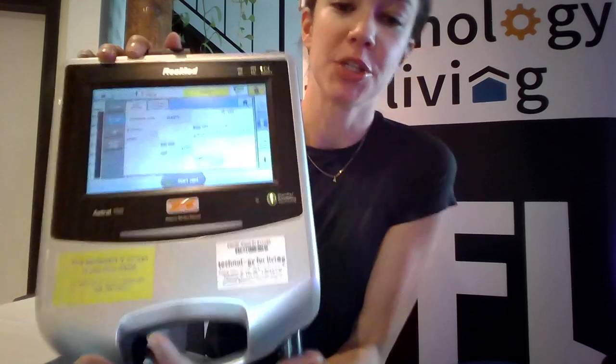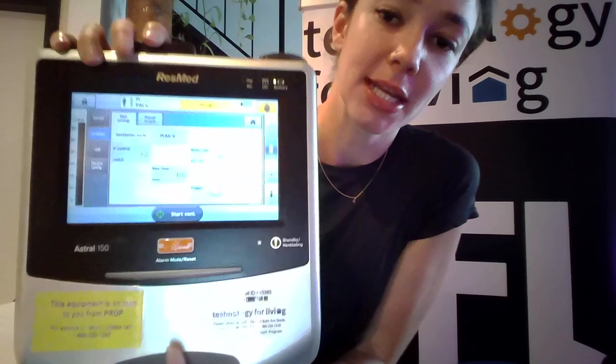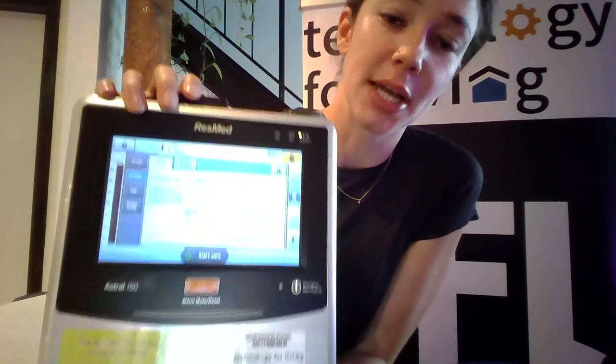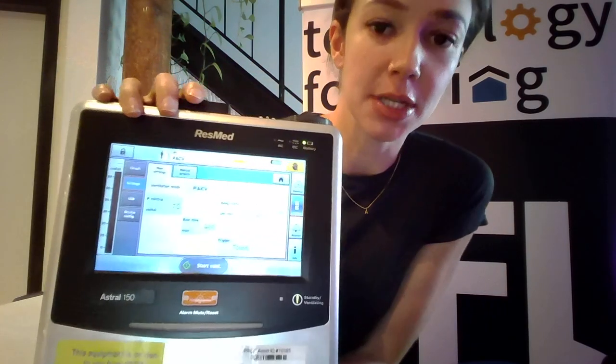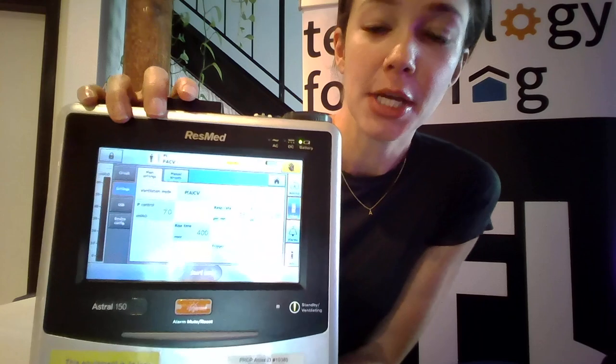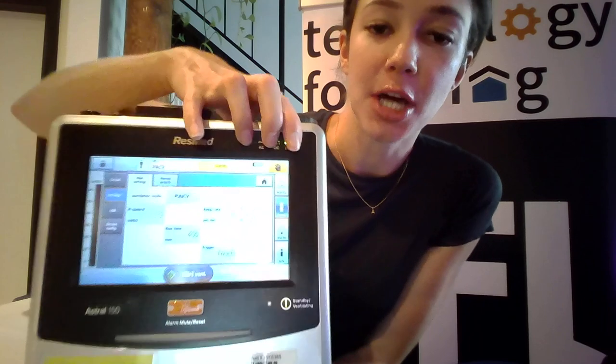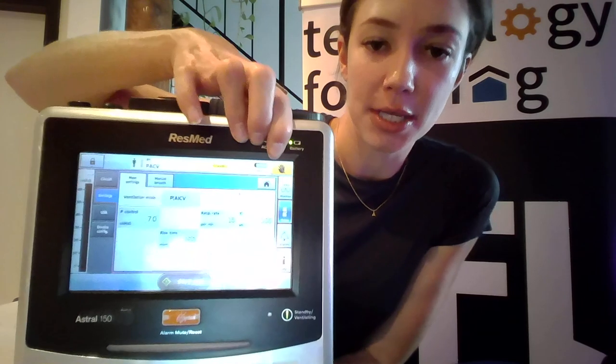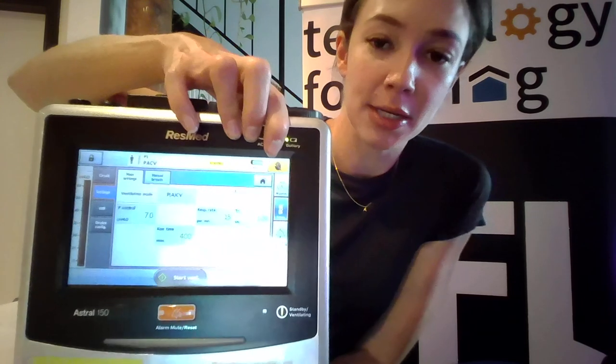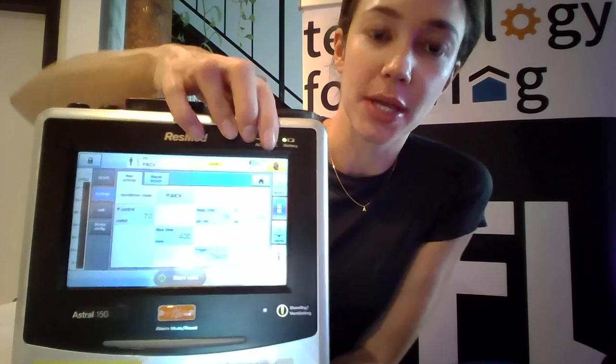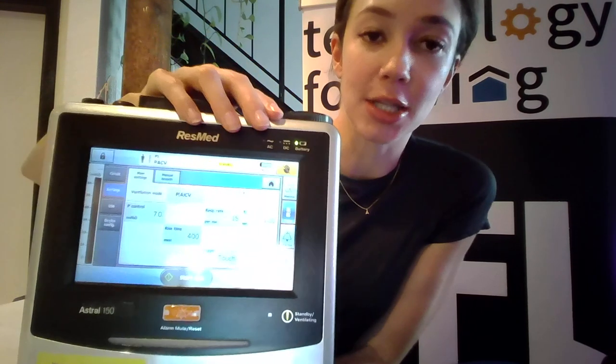This video will demonstrate how to make a setting change or enter into the clinical menu. You'll see in the top corner here this orange button is letting us know that the screen is locked.